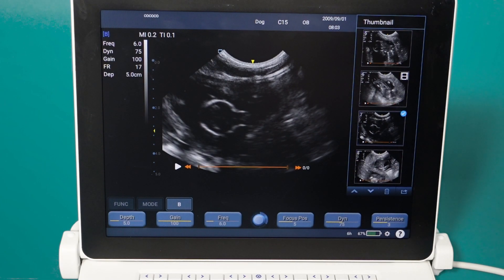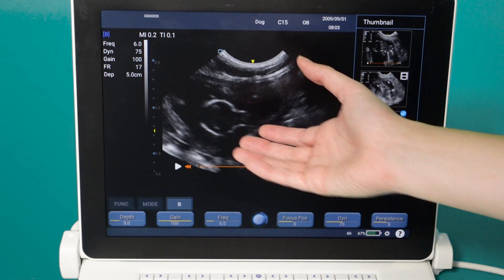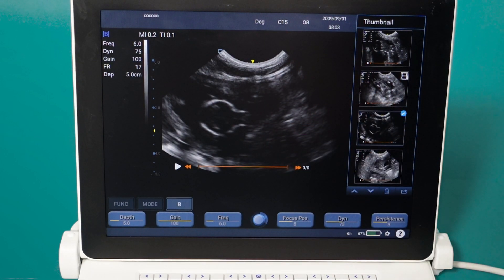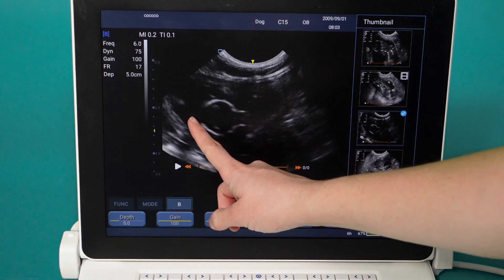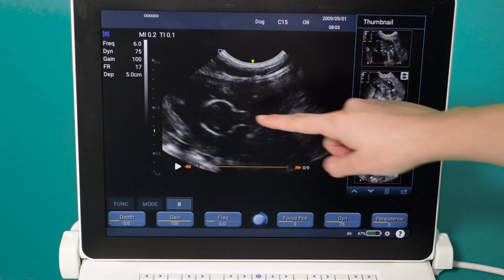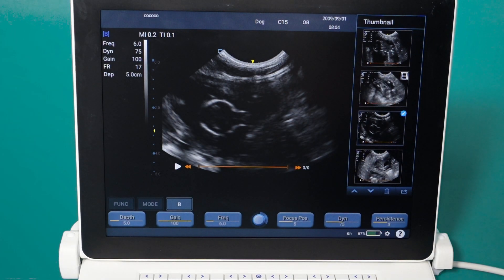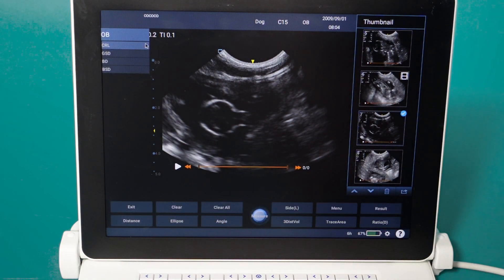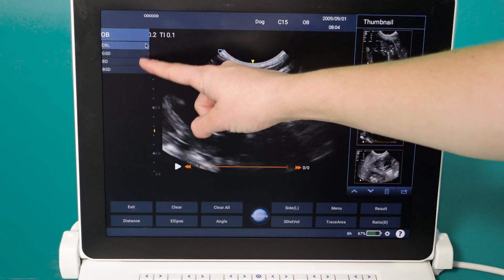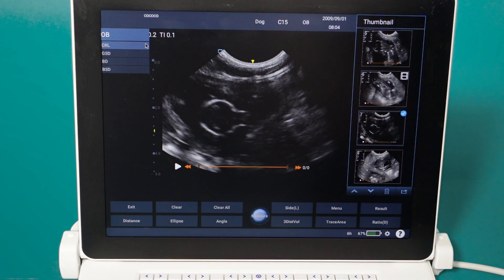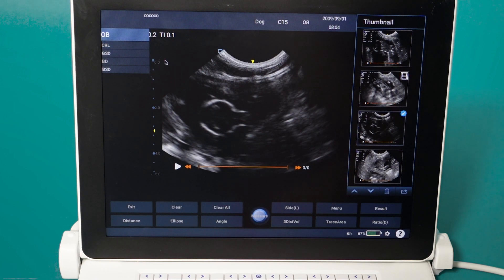To perform a biparietal diameter measurement on a cat, we get the skull on screen exactly the same way as with a dog. This is the front of the head, this is the back of the skull, the midline is here and the two hemispheres of the brain are here. We get our distance calipers — you can ignore the gestational age calculations shown as these are for canine — and select distance.